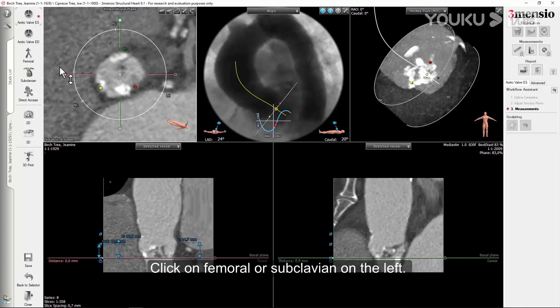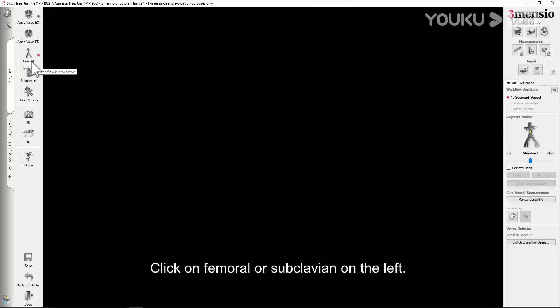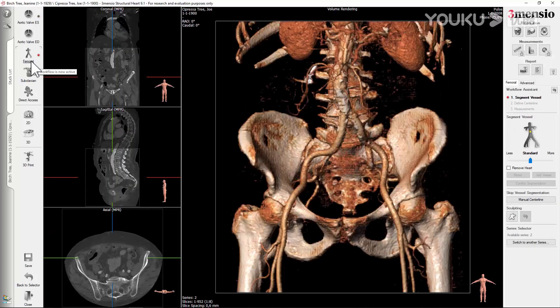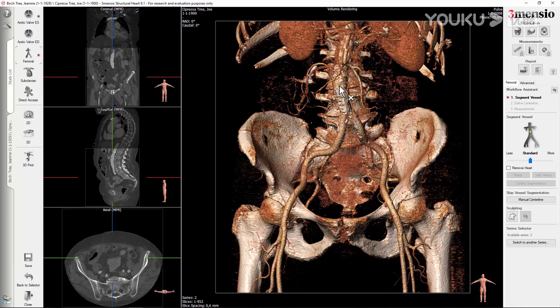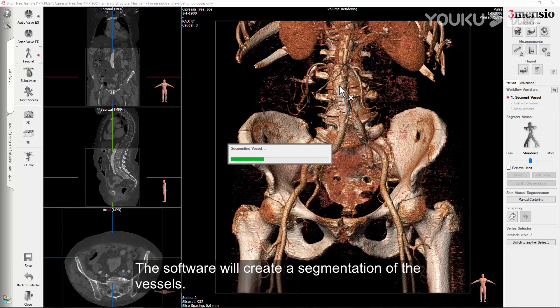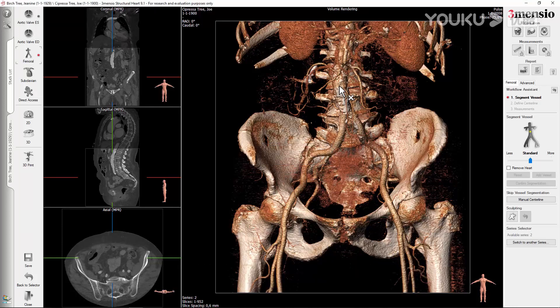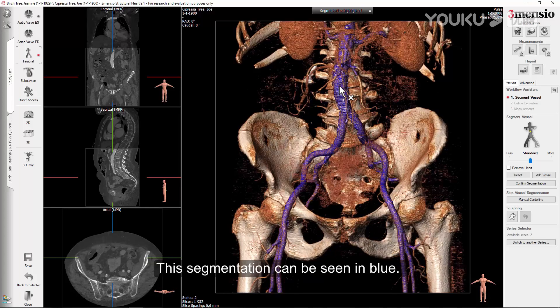Click on femoral or subclavian on the left. Perform a left click on a non-calcified part of the aorta in the volume rendering. The software will create a segmentation of the vessels. This segmentation can be seen in blue.